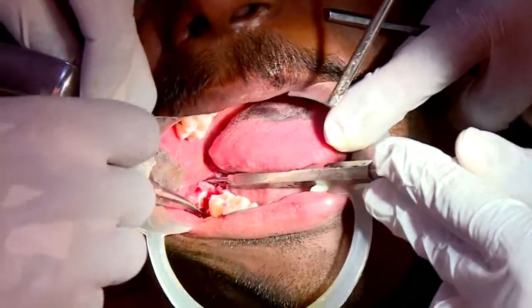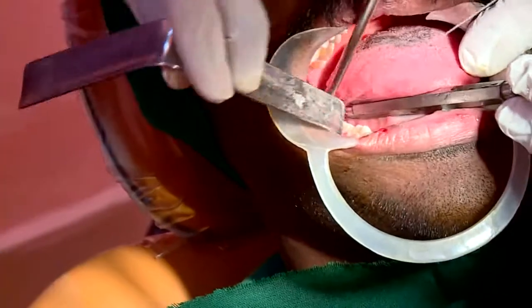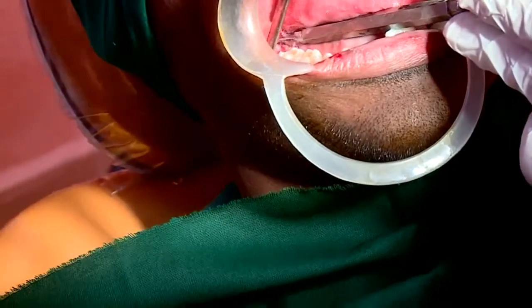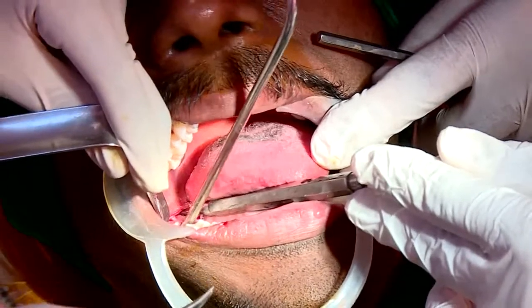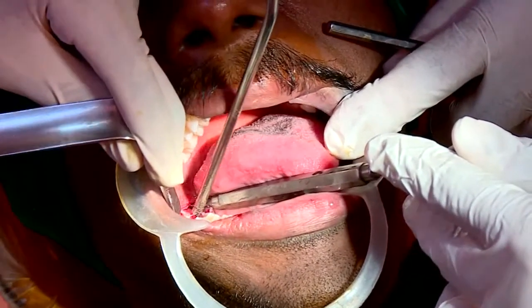Sometimes it happens that the mesial bone is very hard. The mesial bone that is covering the lower part of the crown may still be holding the tooth intact. So it is important to try to get to the mesial part of the bone that is holding the tooth.